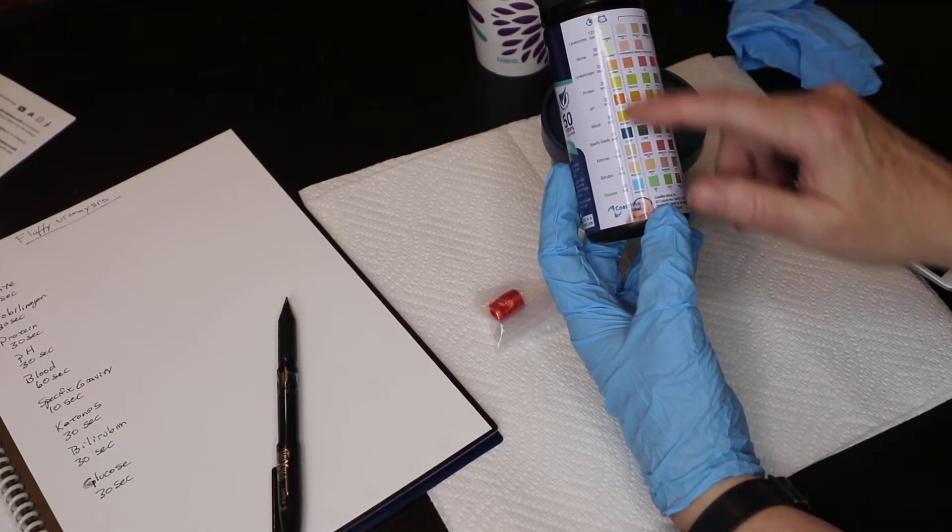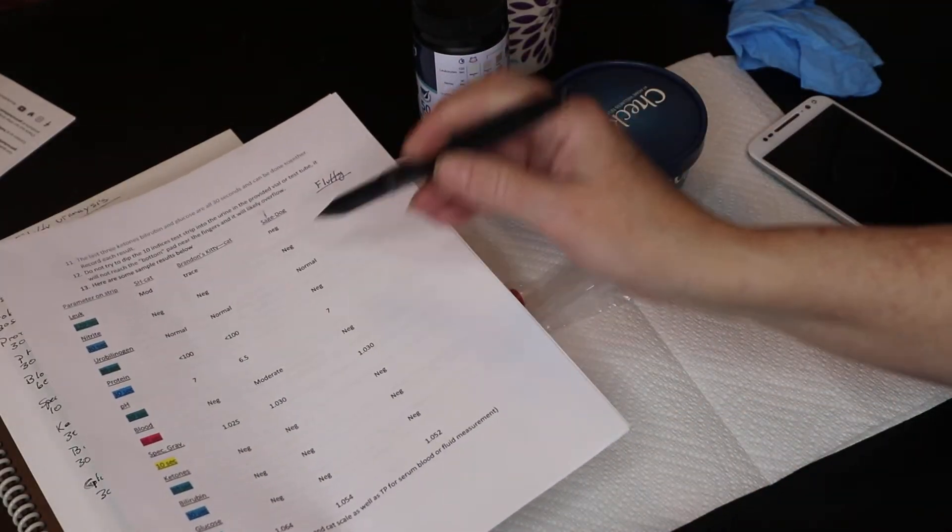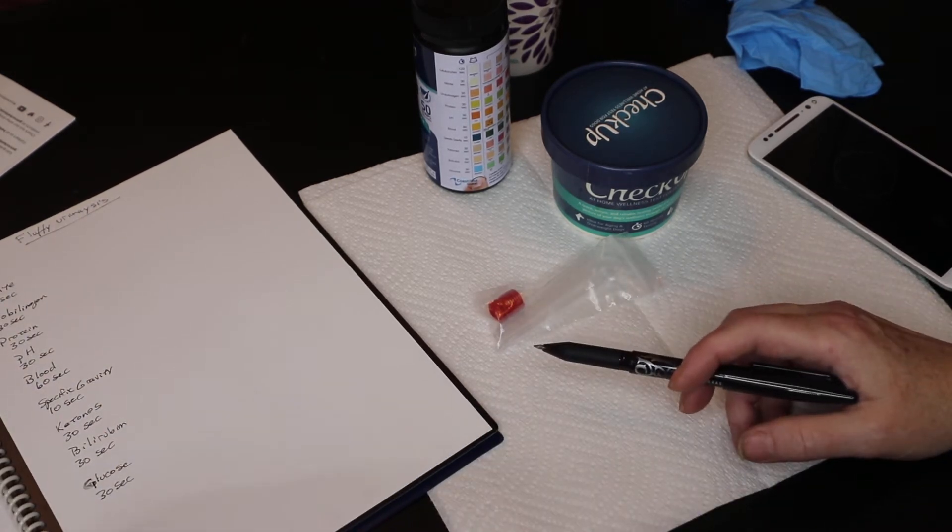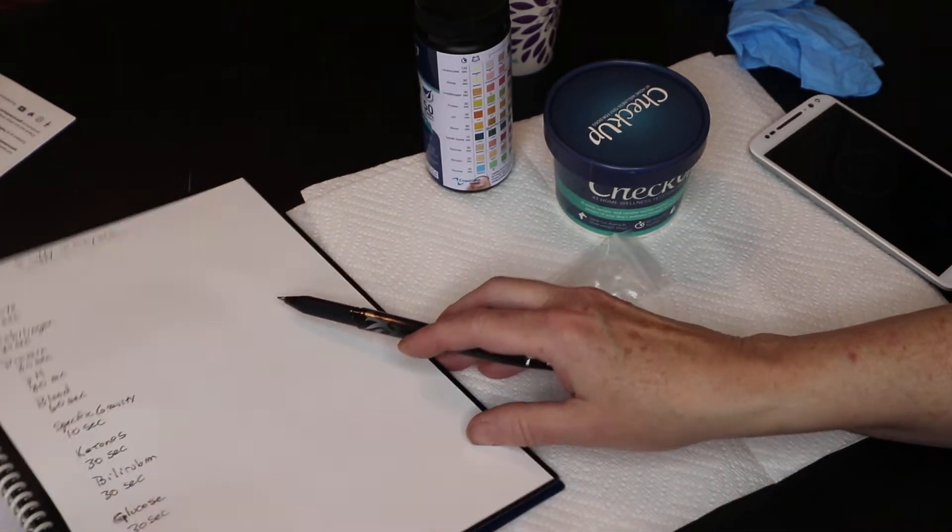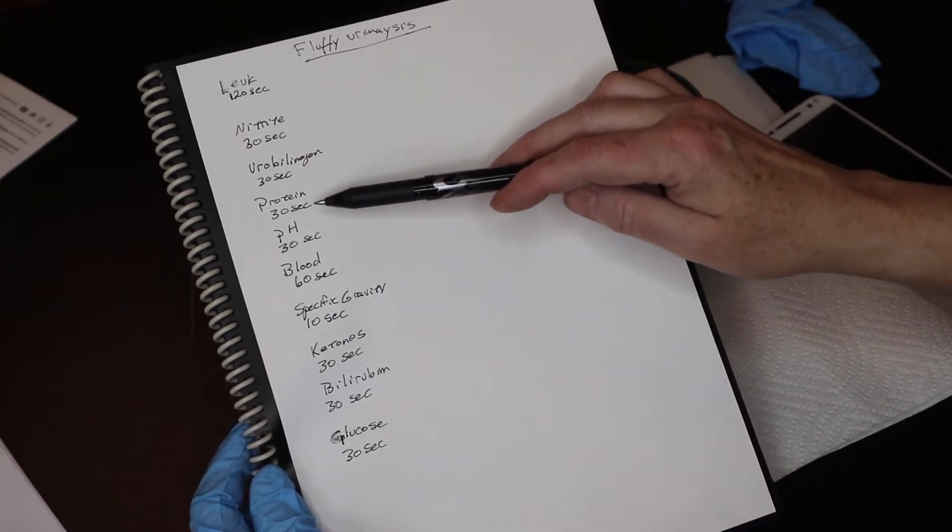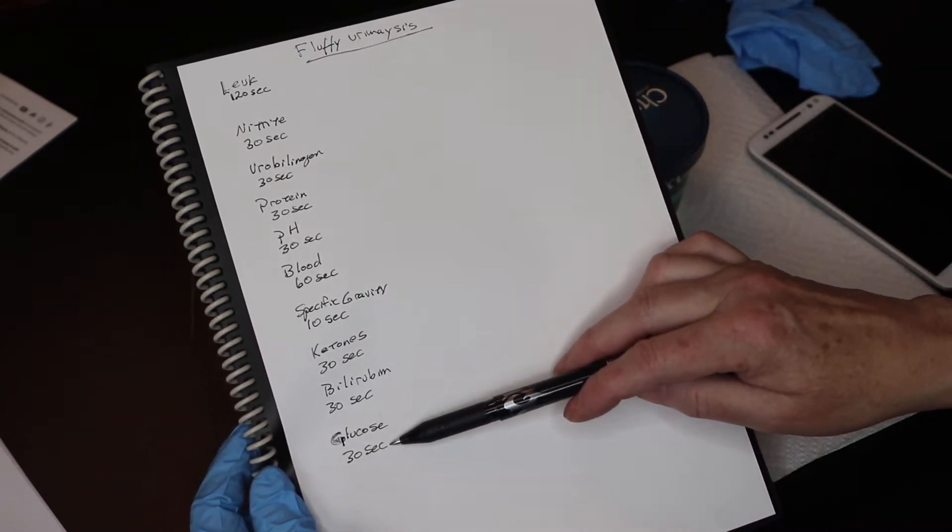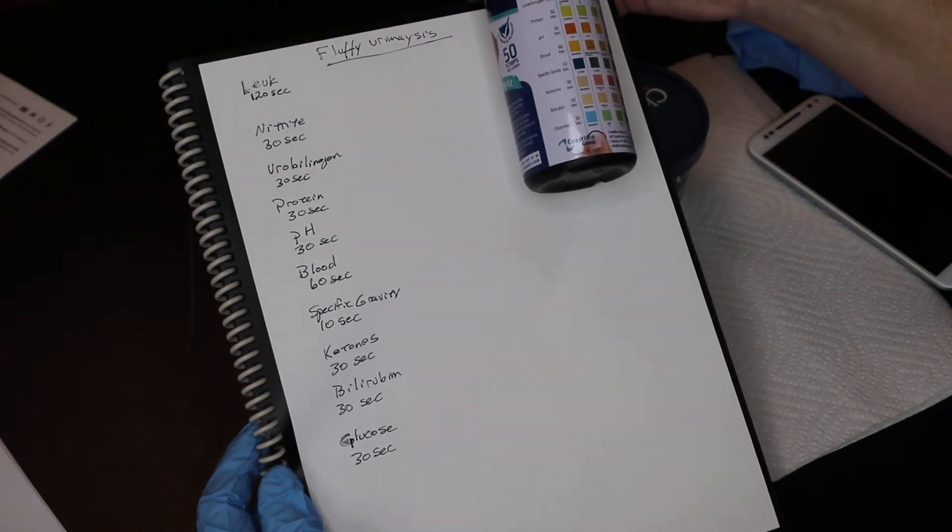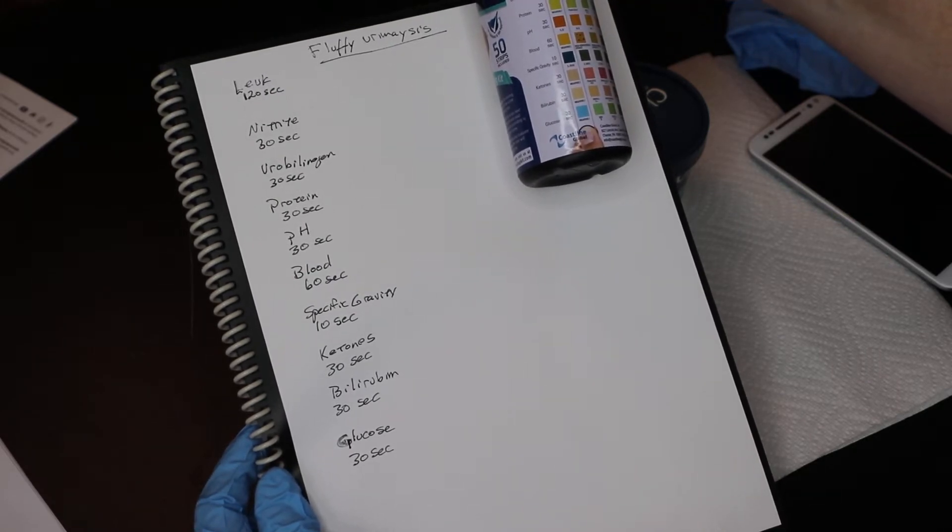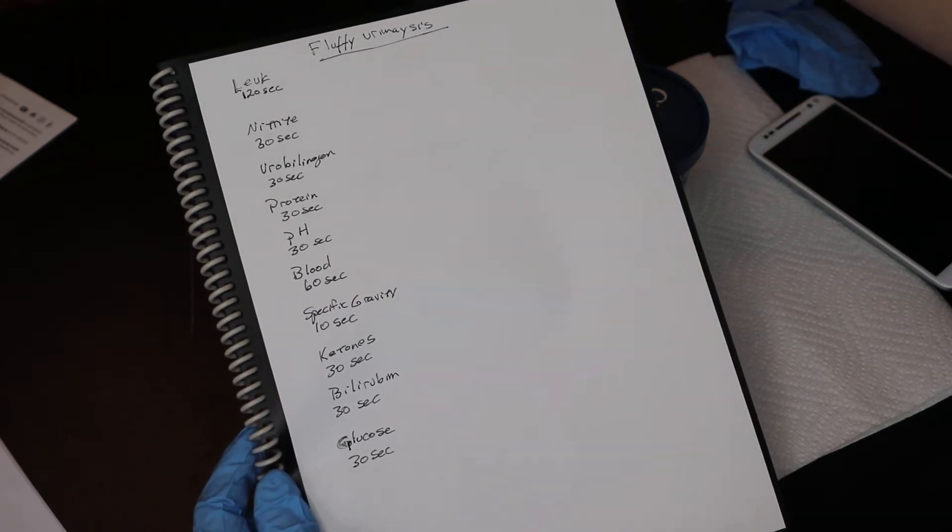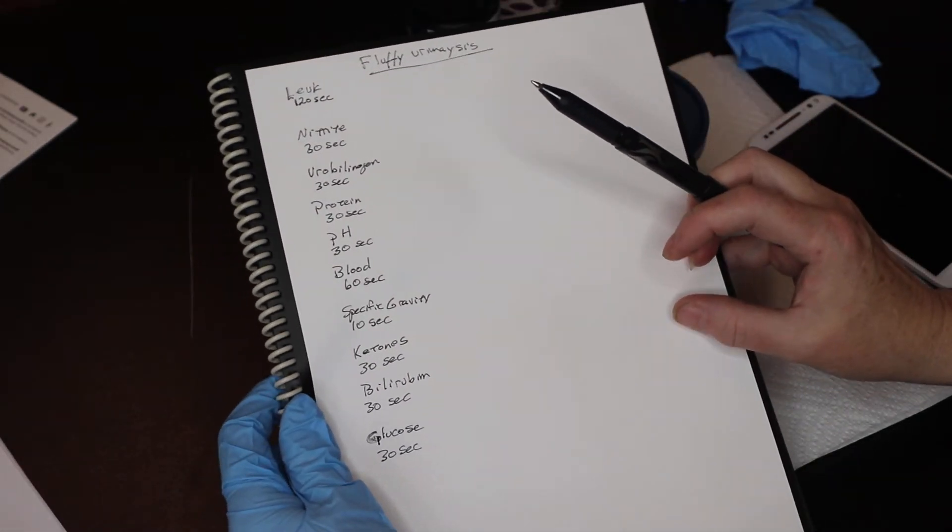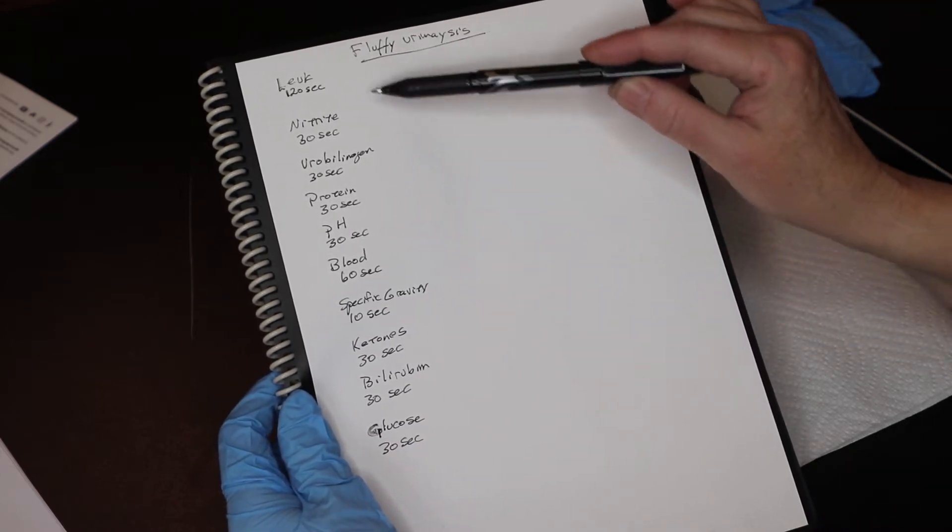You can write these down on a piece of paper or have them printed out so that you can record those indices. I've got a urinalysis here for a pet named Fluffy and I have the times for each of those indices written out here as well. As you'll notice on the test strips, the times are different for each of the blocks of test pad. So need to keep in mind those times as we go through. So we will be running the test slightly different than what is recommended on the directions.